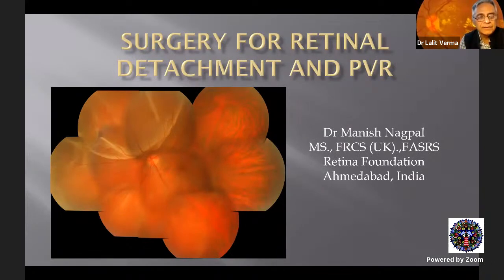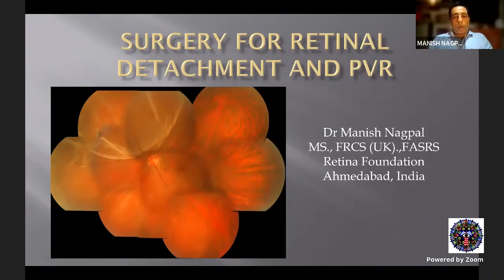Okay. So I'll be talking about retinal detachments and take you stepwise from a bit of basics to complex cases, and talk about vitrectomy being done mainly because that's what we use today. Also show a bit of buckling, which we do in a modified manner using the vitrectomy-based viewing systems. A bit of GRTs and of course PVR. So I'll just take you through these step by step. And I think at the end of the talk, questions we could take up as they come.